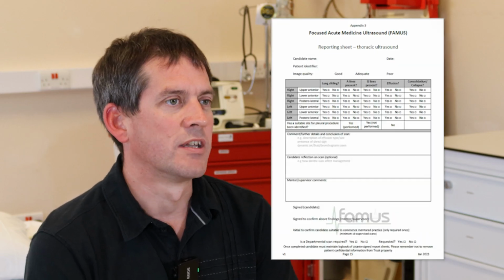We're now going to go through some of the more frequently asked questions around the training process. The first of which is whether you need to report your scans, and the answer to that is yes, we ask that you report all of your training scans, although of course without having any patient identifiable information. We provide an example reporting sheet here, but the importance is that you have access to both your report and your images so that you can go through these with your mentor and supervisor in your mentored practice stage, so you're able to consolidate the learning and make sure that your clinical diagnosis is correct.